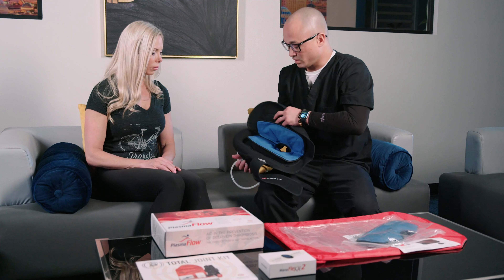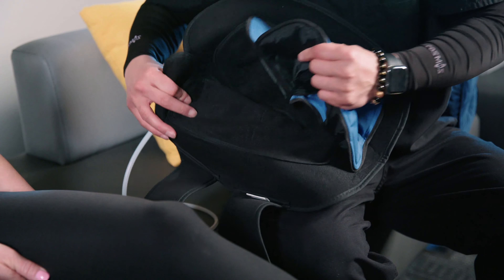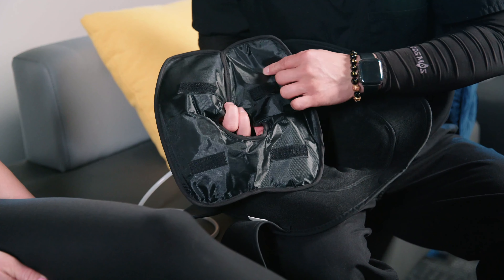This is your EZ-ROM ice — it's your knee brace with gel pack attachments to help reduce your swelling and your pain. Inside the gel packs they do have velcro to keep the ice pack attached.